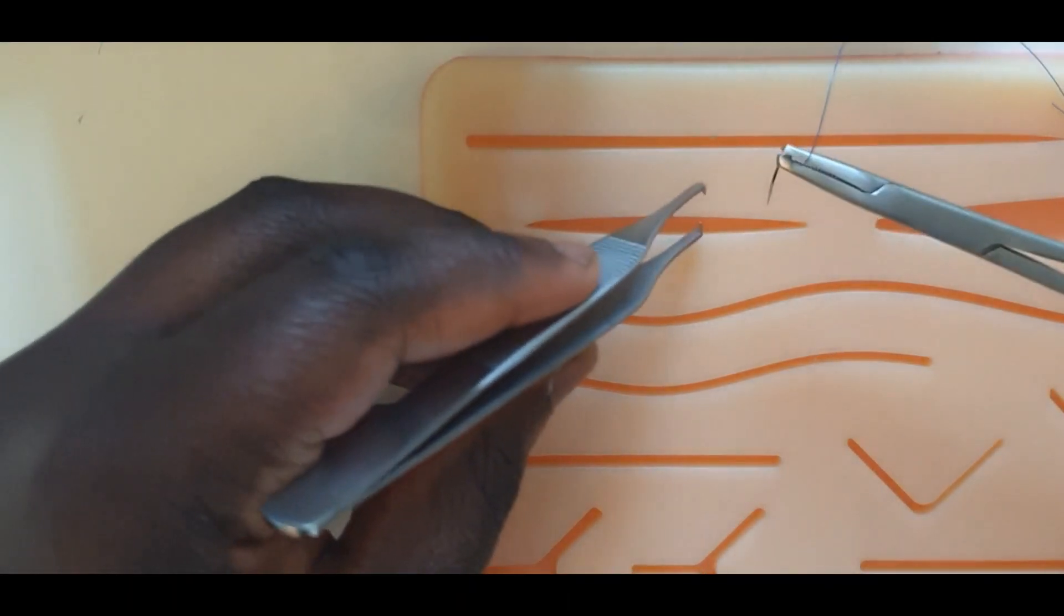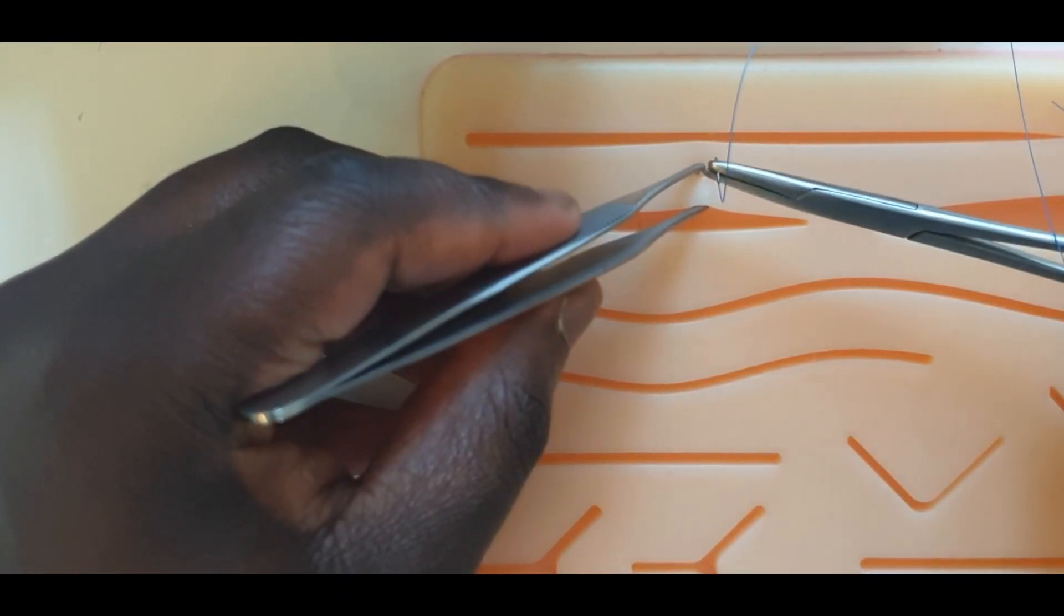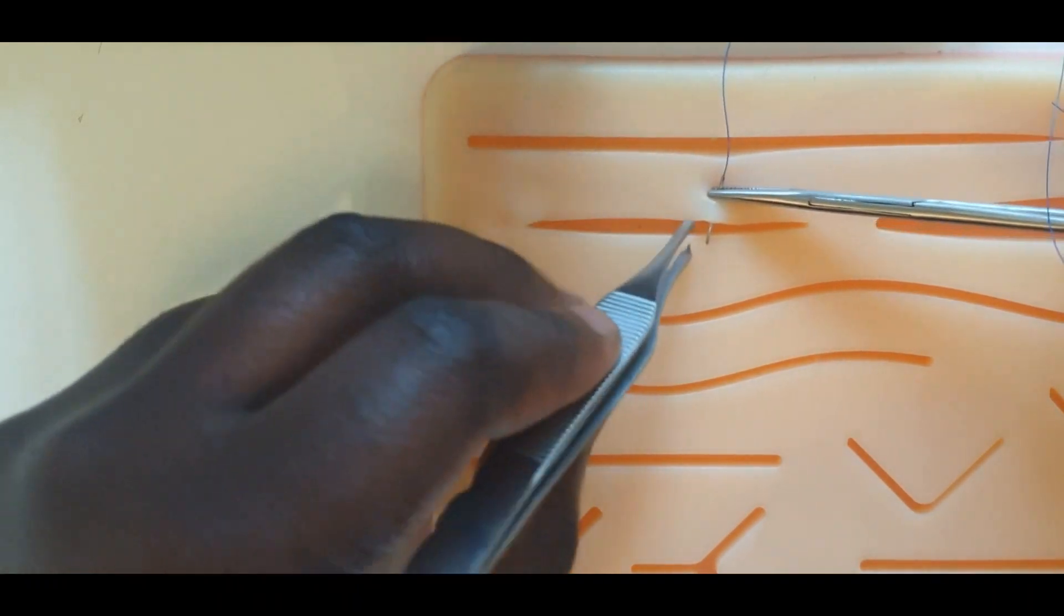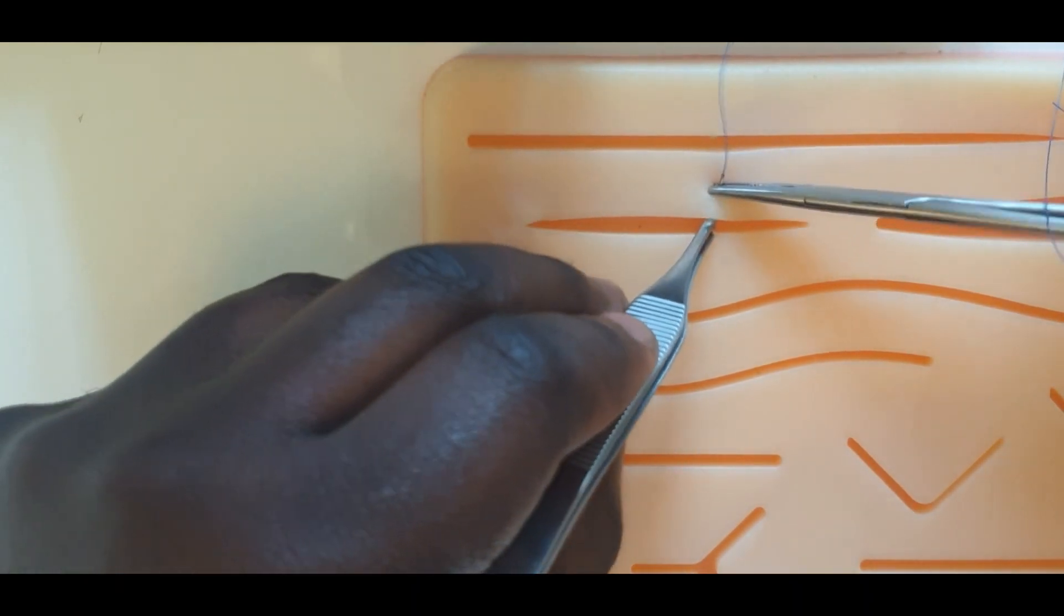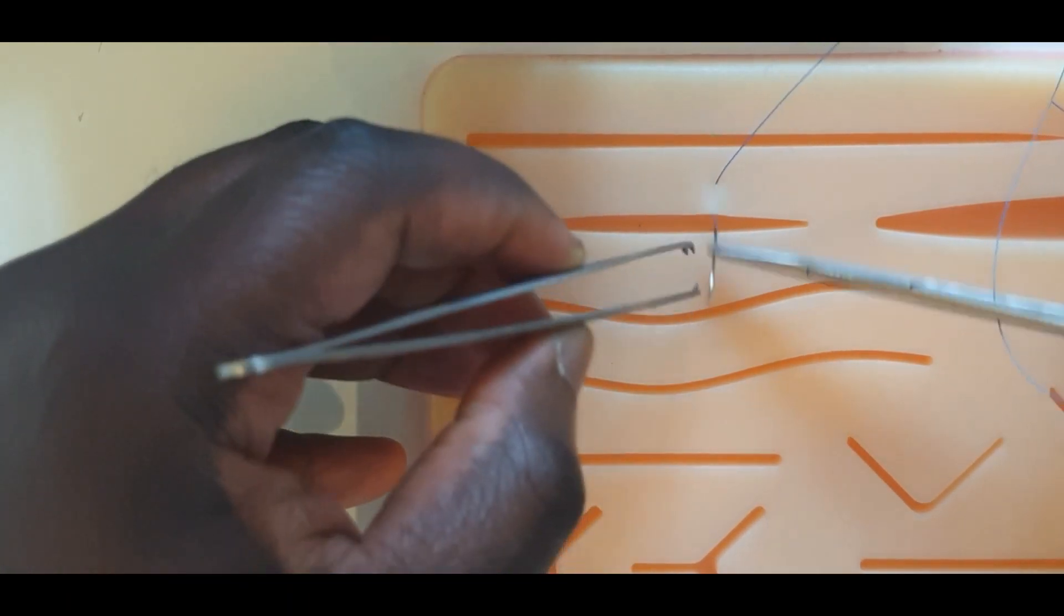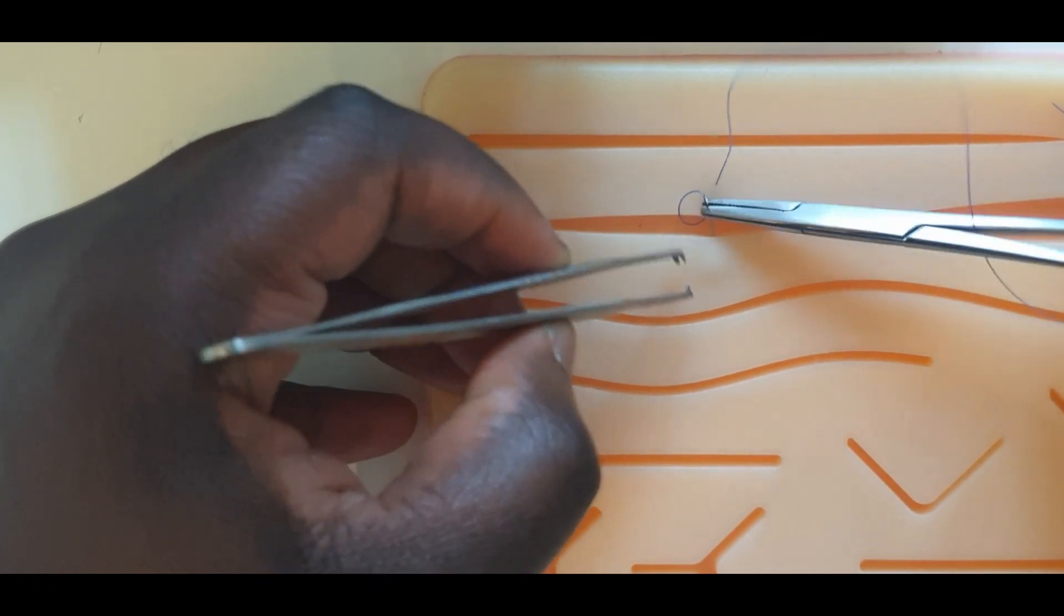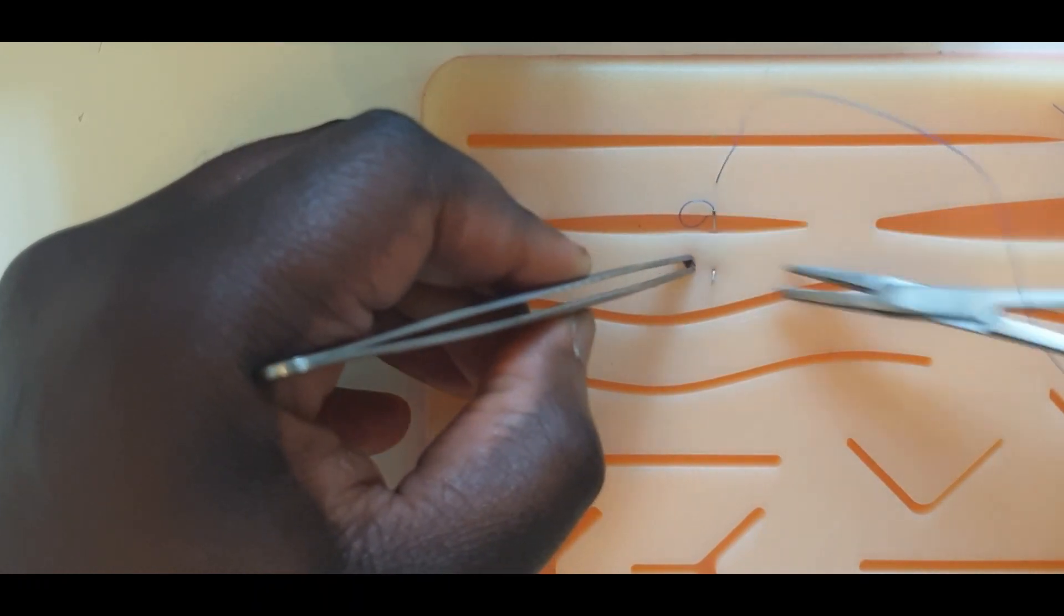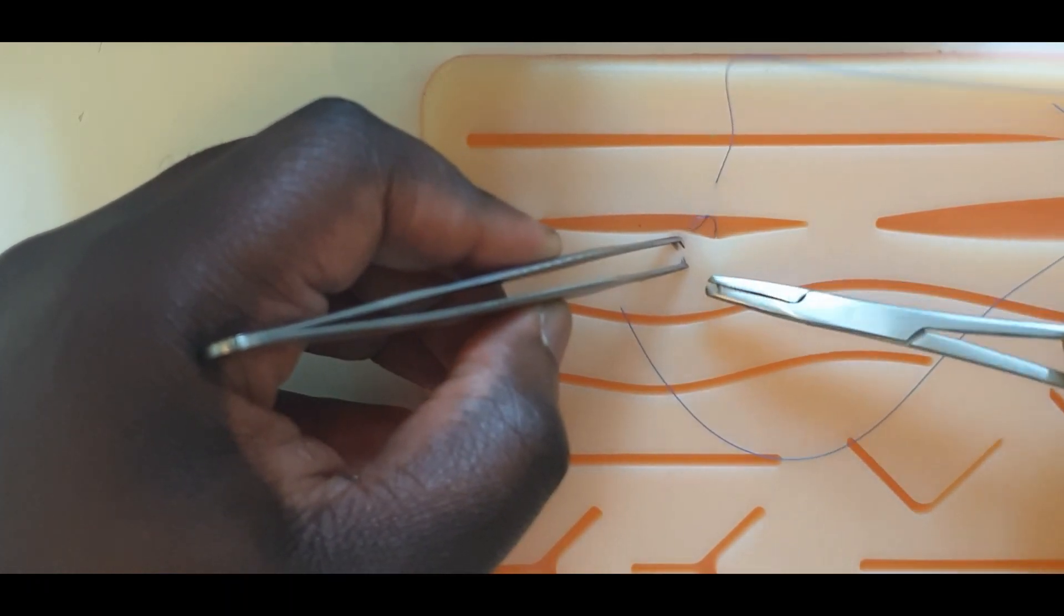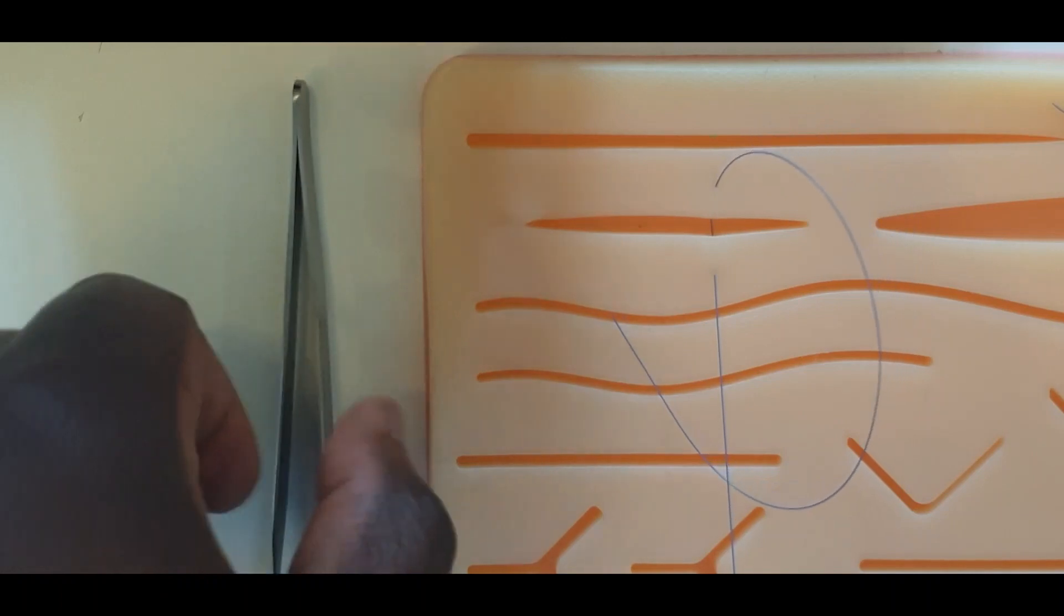Some wounds have distracting forces of tension such that your initial surgeon's knot will not hold. To avoid this initial knot loosening, one technique you can employ is to lock the knot to one side of the wound edge.